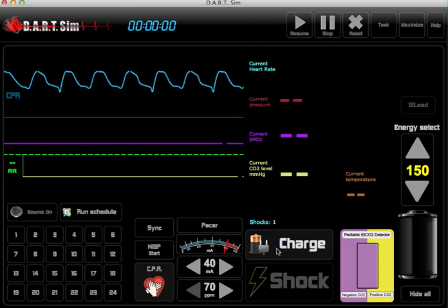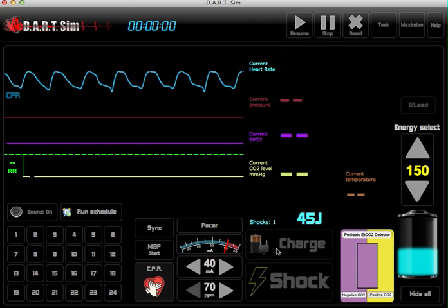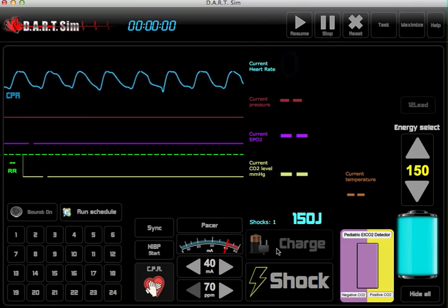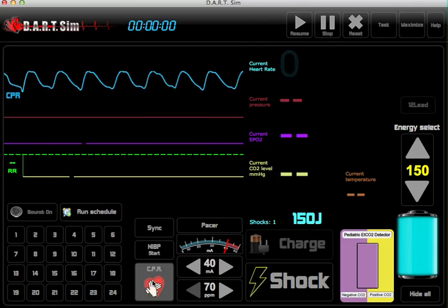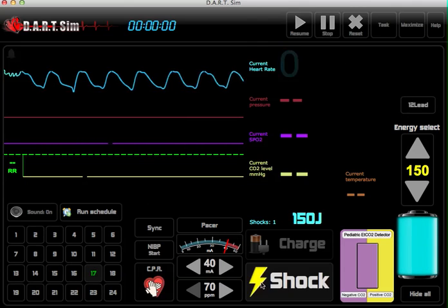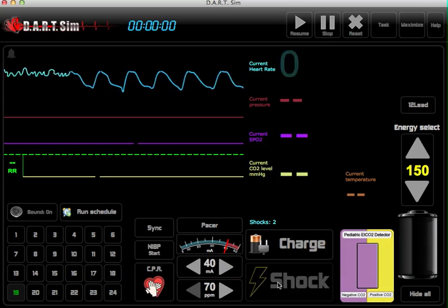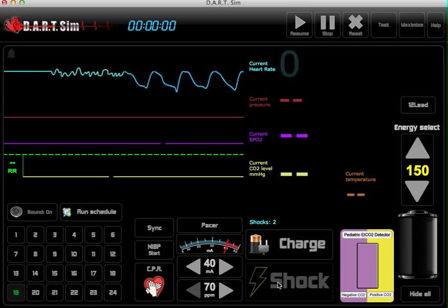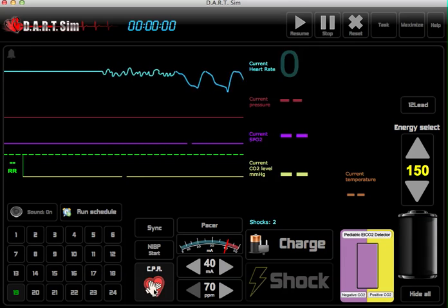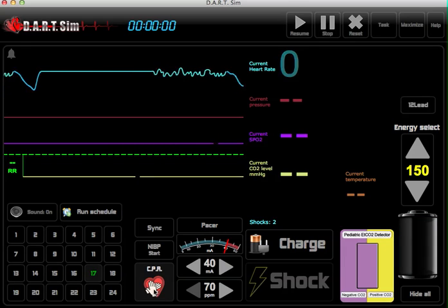And then you just charge. You can stop compressions and give that shock, and then resume CPR.